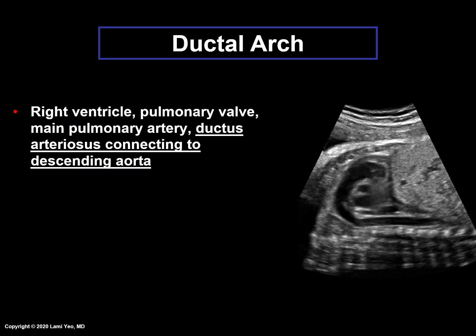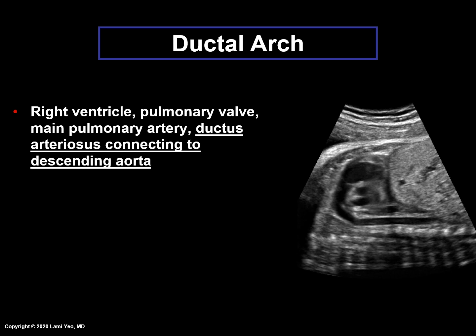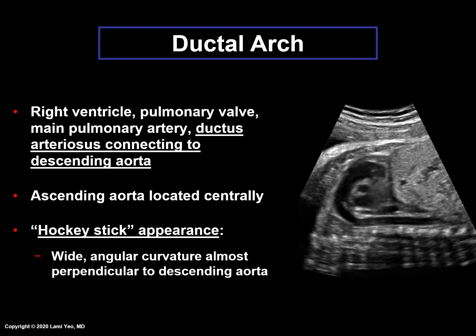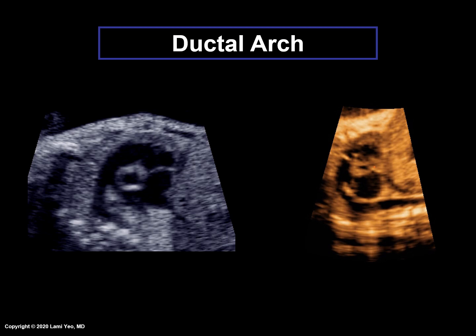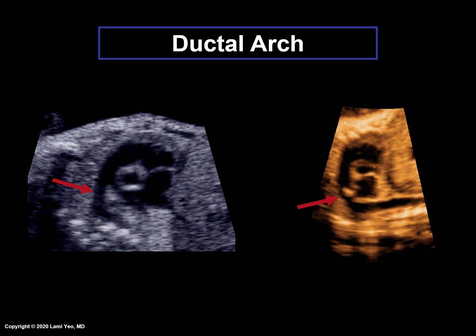Ductal arch. The ductal arch consists of the right ventricle, pulmonary valve, main pulmonary artery, and the ductus arteriosus connecting to the descending aorta. The ascending aorta is located centrally. One of the characteristics of the ductal arch is that it has a hockey stick appearance because it is derived from the pulmonary artery. Therefore, the ductal arch has a wide curvature that is almost perpendicular to the descending aorta. It is noteworthy that the normal ductal arch can look different depending on the fetus. The ductus arteriosus may appear wide in some fetuses but more narrow in others, yet still be normal.